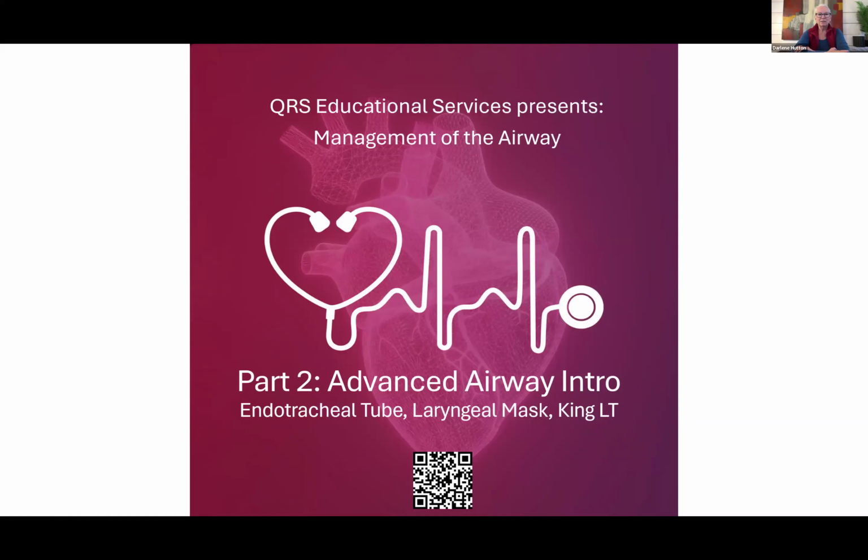This is our second of 7 series in the Airway Management YouTube videos. This segment will be looking at advanced airway, just an introduction to it. I'm going to talk about the pros and the cons and show you examples of endotracheal tube, laryngeal mask airway, and King LT. These will all be featured in more detail in subsequent videos.